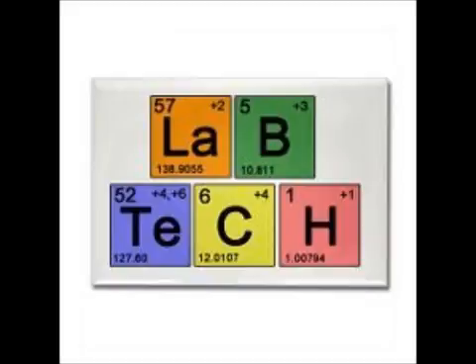This is its hallmark test. 5 molar urea is abnormal. ProTime and PTT are normal. For every factor, you're going to have to tell me what is abnormal, ProTime, PTT, on every one.